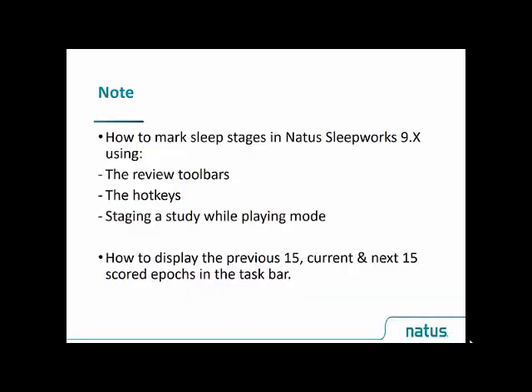We'll demonstrate how to mark sleep stages in Natus SleepWorks using the review toolbars, the hotkeys, staging a study while playing mode, and how to display the previous 15, current, and next 15 scored epochs in the taskbar.